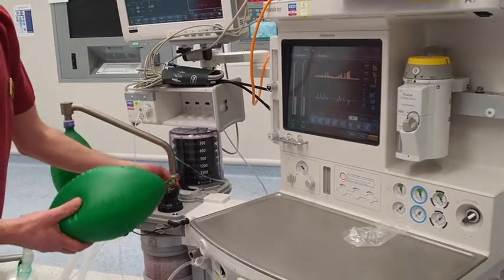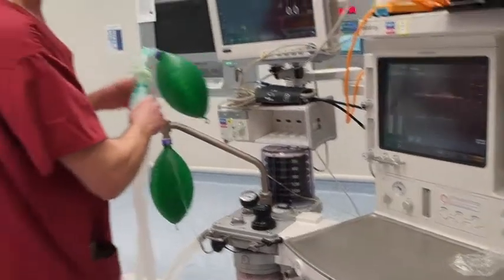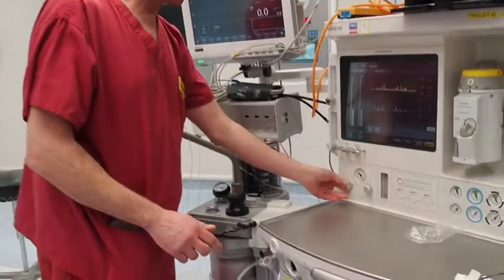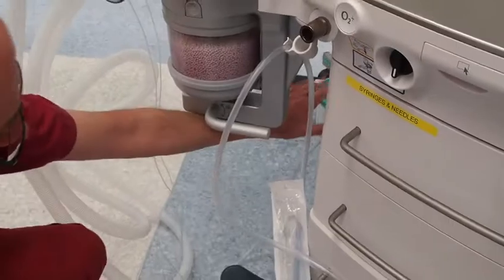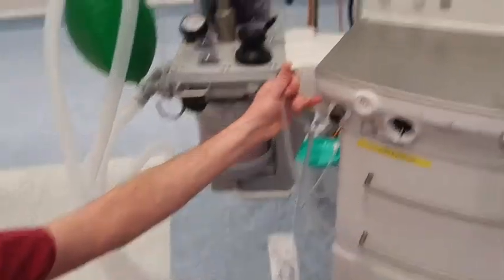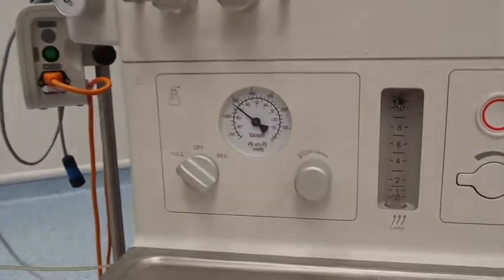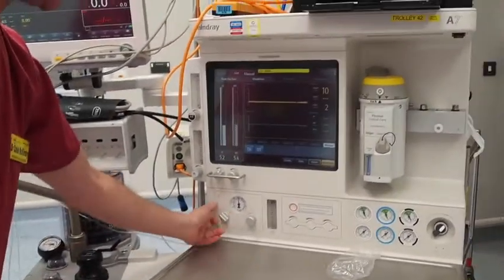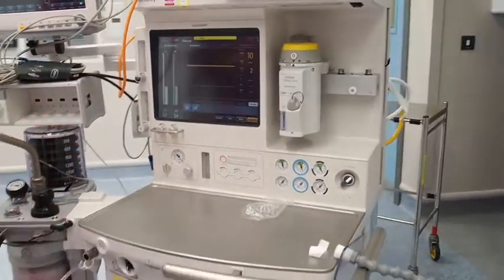So I'm going to go back onto manual here just to stop this alarming. It probably will give an apnea alarm a little bit. Other things to be aware of is your suction is actually built in here. So you can turn on the full suction, and the suction is down here, and you'll be able to just follow that through and work it out. And if you check the suction, if you click it, it'll go down by minus 60, and that way you know it's working fine. And that's full suction or just pressure regulated suction, the same way as ITU suction works.